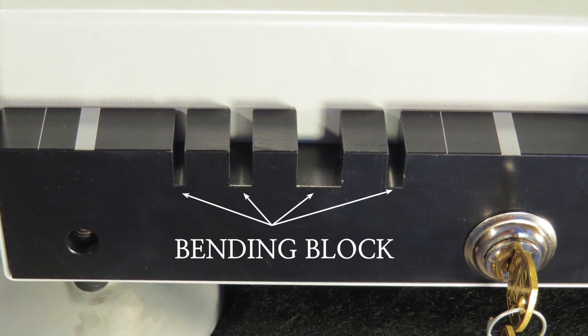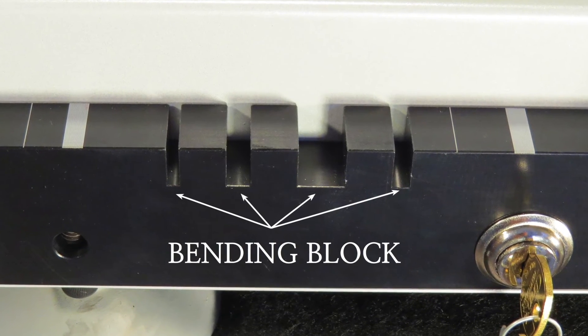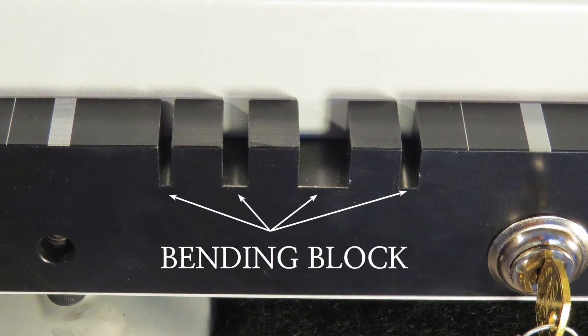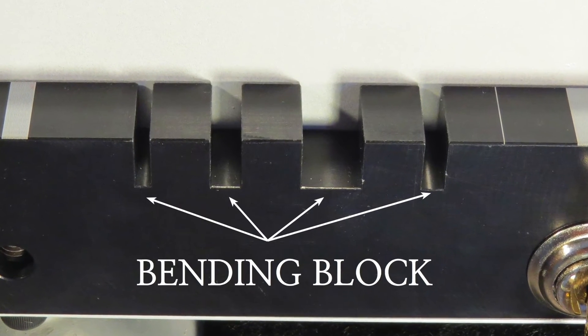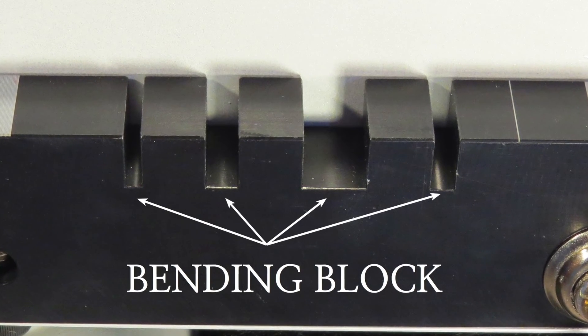Bending Block: The bending block is used to hold the surgical instruments firmly while opposing pressure is applied to the instrument so that it may be bent to its correct position. It has several slots that are different sizes to accommodate different bending needs.